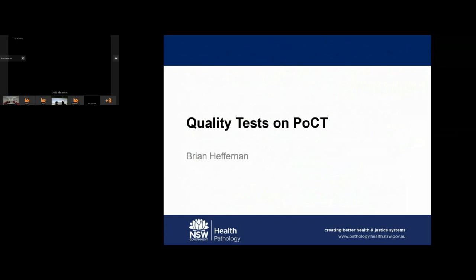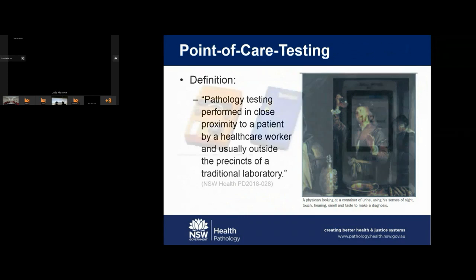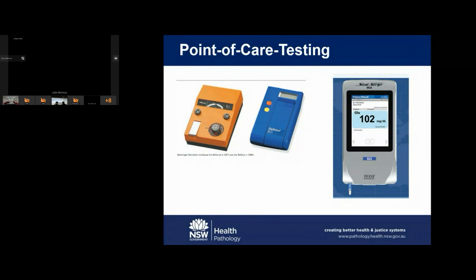So point of care testing has been around for quite some time. And in fact, lab testing evolved from point of care, not the other way around. And then comes the age of machines. The reflectance glucose meter you can see on the left of your screen is approximately 40 years old. The glucose meter on the right is the current state of the art and can give you results in a matter of seconds and is able to transmit directly into the EMR.